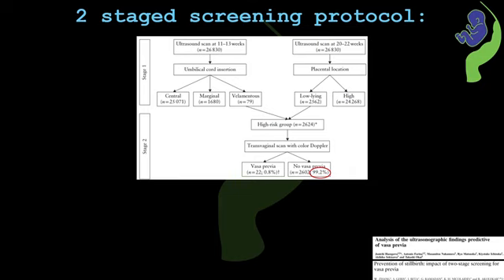Now stage 2 is where the actual diagnostic test for vasa previa happens, and all patients belonging to the high risk category from stage 1 will undergo transvaginal scan with color Doppler and pulse wave Doppler. Using this two-stage protocol in this cohort, they found that 99.2% did not have vasa previa after proper targeted Doppler evaluation, and 0.8% of the cases were confirmed to have vasa previa. In my personal opinion, this two-stage screening protocol is a very structured and logical way to screen for vasa previa.